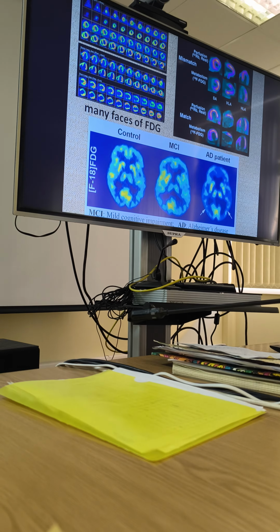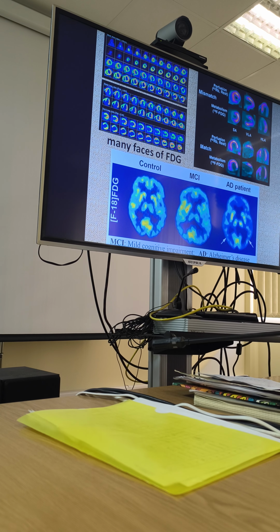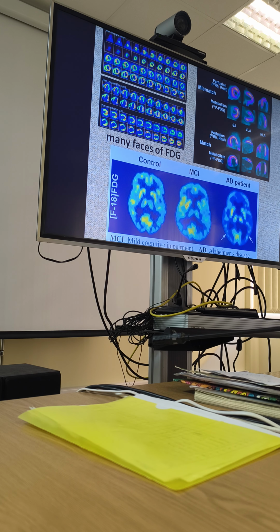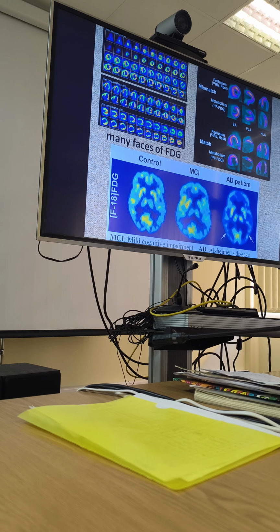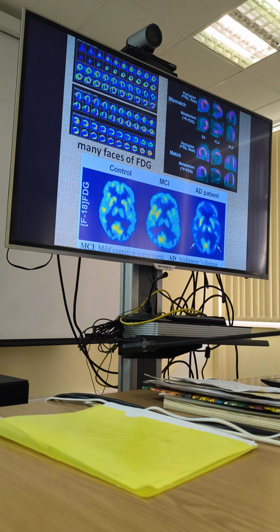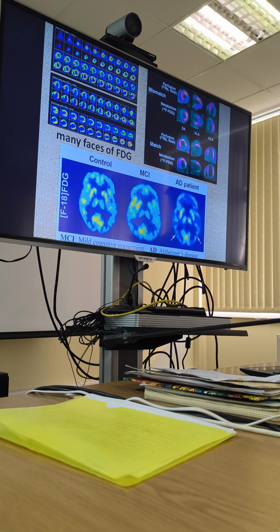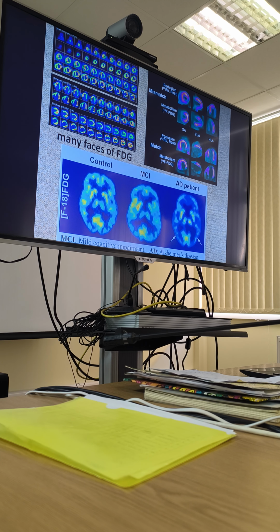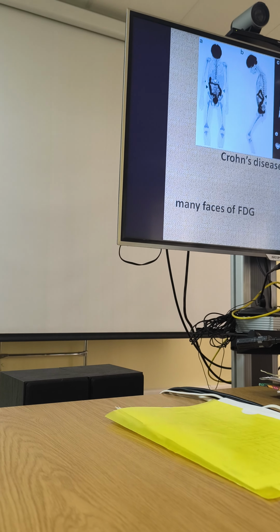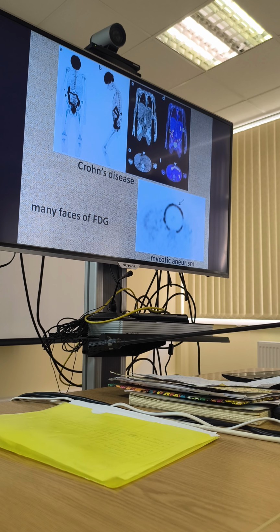And pay attention that this is a really popular idea in R&D to make what we name paired studies. What are paired studies? That means that we use two different radiopharmaceuticals which produce different information about different aspects of functioning, and then we compare them. And we make conclusions from this comparison, like in this situation. So this is what is named a paired study. This is not the only one. And there is one more thing which we can do really cool using this FDG thing.